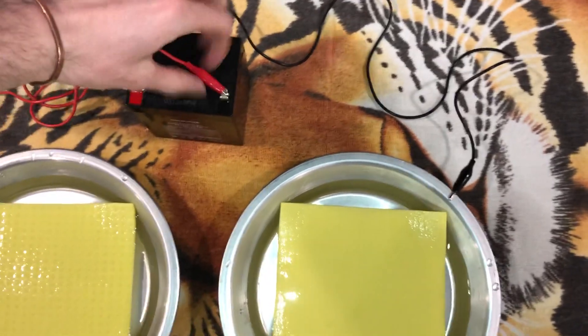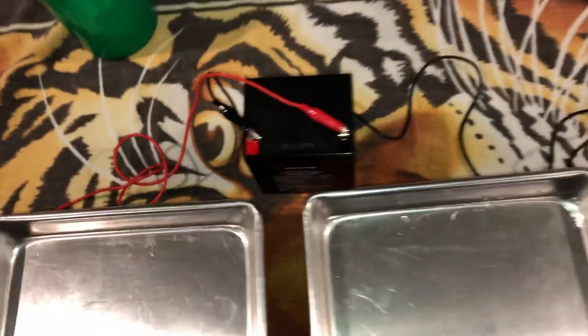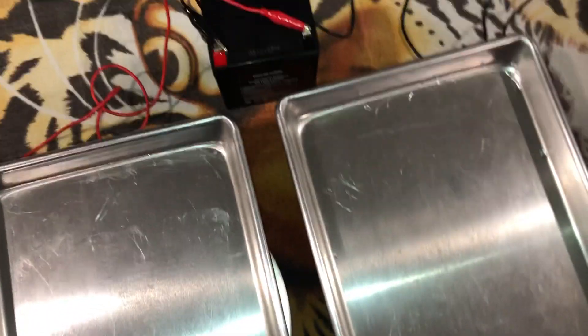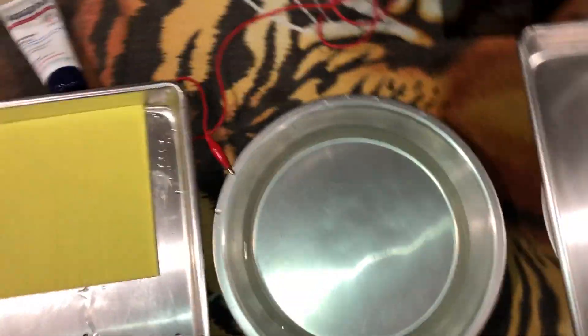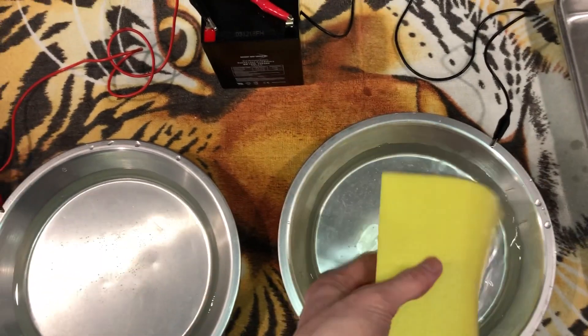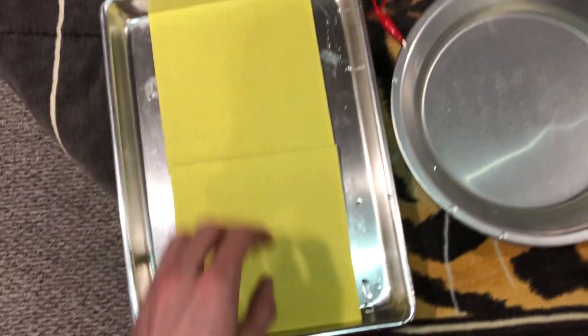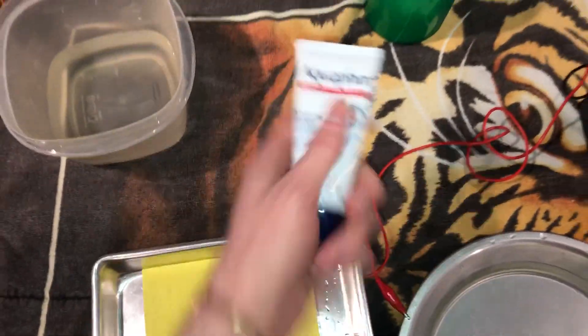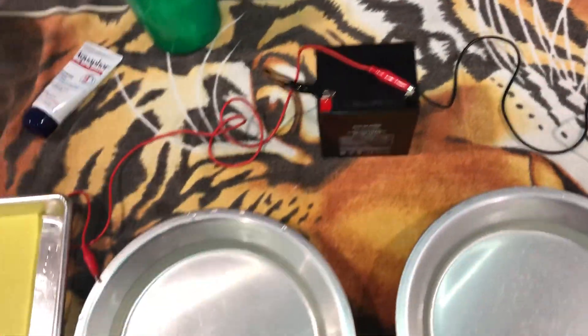For your feet, just put the larger trays on the floor, connect your clips to each side just like you did with the pie pans, then put your sponges in — this is going to save you a lot of leg ache. Put aquaphor on your feet, throw in some Epsom salts, make sure everything's connected, then do the same thing: 20 minutes, switch the clips, 20 more minutes.